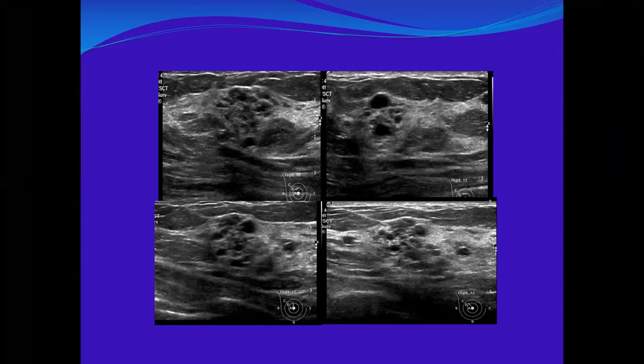Biopsy was reported as optional. I don't know, related to the physicians or the patient's concern or whatever. Biopsy had been done and it was proven to be fibrocystic. Okay? So we describe that focal asymmetry can be caused by fibrocystic change.